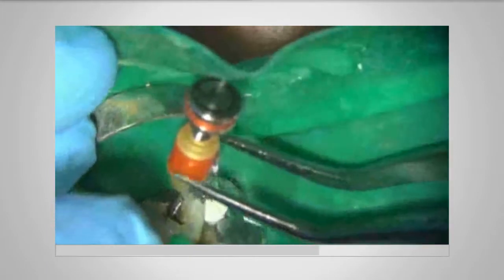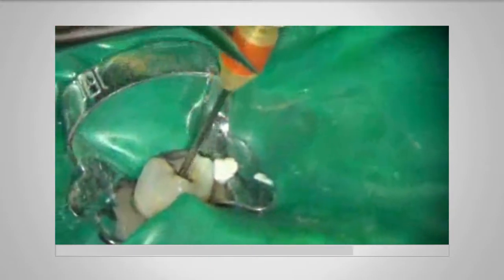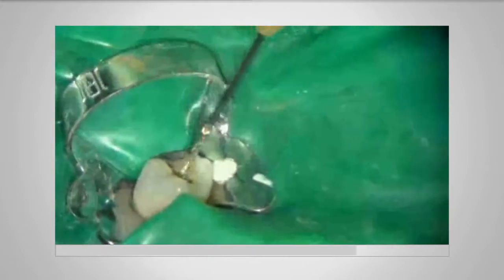If it doesn't seat straight away, give it a little turn clockwise, and then once it's engaged, it will turn anti-clockwise until you feel it lock the piece of broken instrument into the tube. I then use the tweezers to gently retrieve, and there's the piece of broken instrument in the remover.